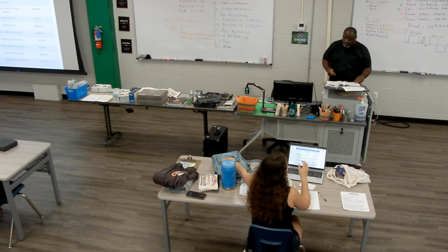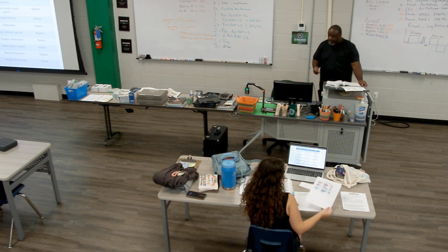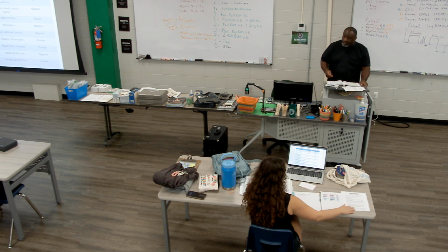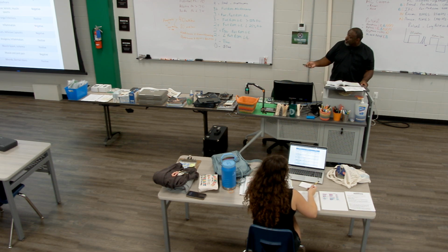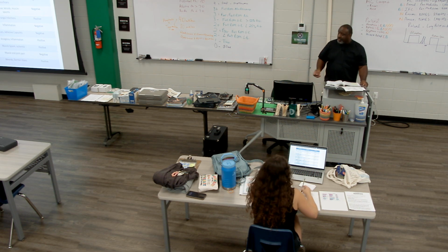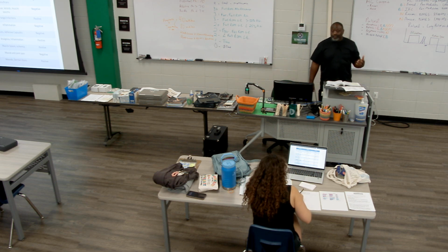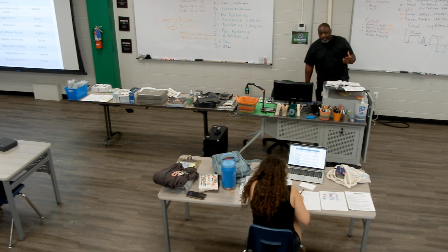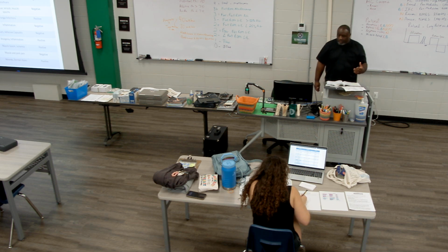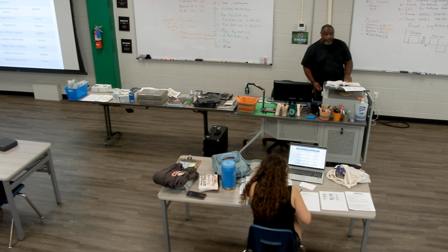So those are the drugs that we would iontophoresis underneath the electrode. The goal is you'll need to know why we're using it, and just as important, what's the polarity? Because the polarity tells you what polarity of your iontophoresis device you're going to need to use to actually do the effective thing you want done in the tissue. Without that, you're going to miss it. So it's very important that you have that clarity on that.